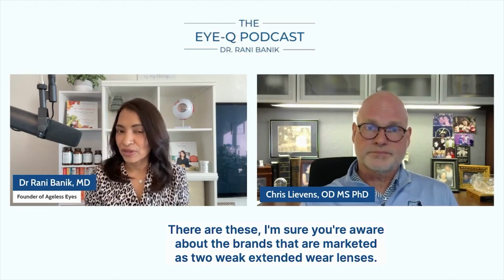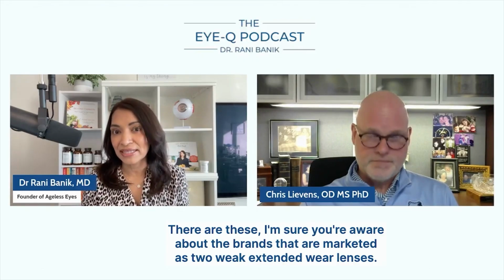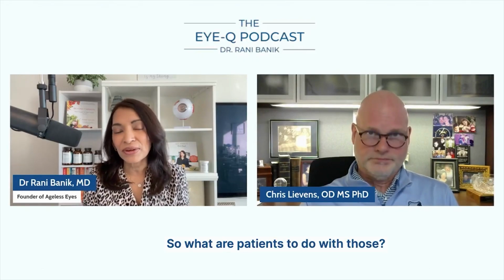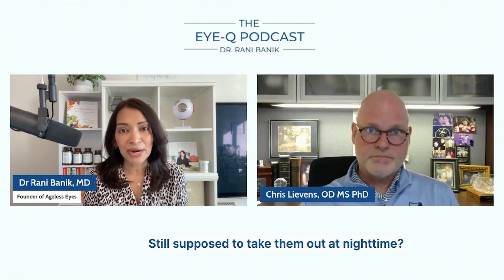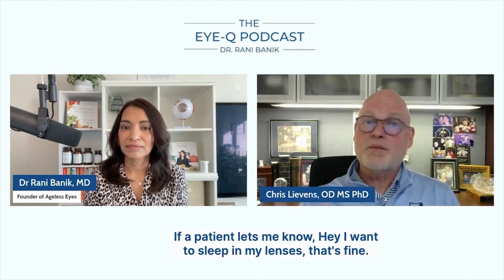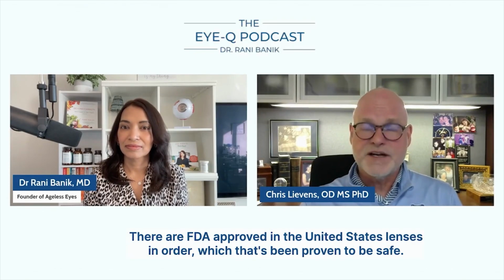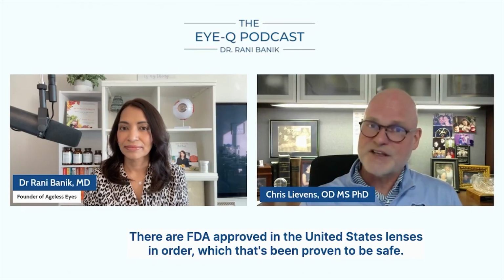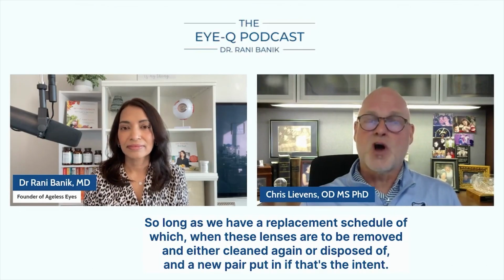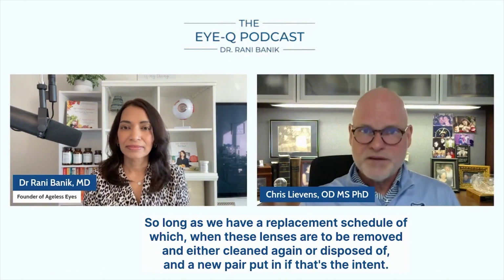I'm sure you're aware of the brands that are marketed as 2-week extended wear lenses. So what are patients to do with those? They're still supposed to take them out at nighttime? No. If the patient lets me know, hey, I want to sleep in my lenses, that's fine. There are FDA approved lenses in the United States for which that's been proven to be safe. So long as we have a replacement schedule of when these lenses are to be removed and either cleaned again or disposed of and a new pair put in, if that's the intent.